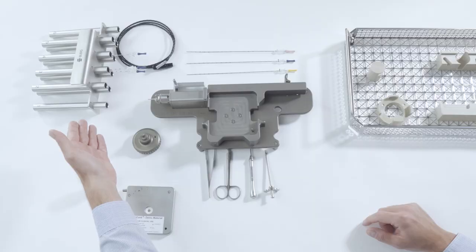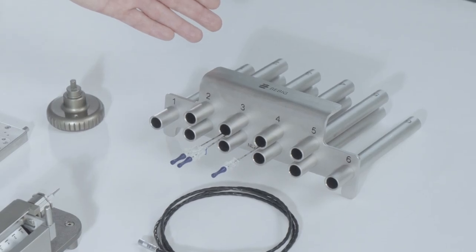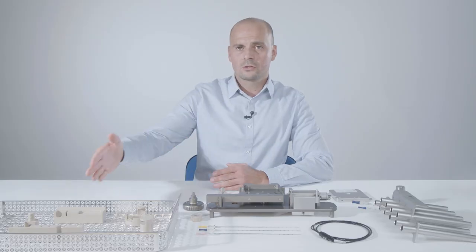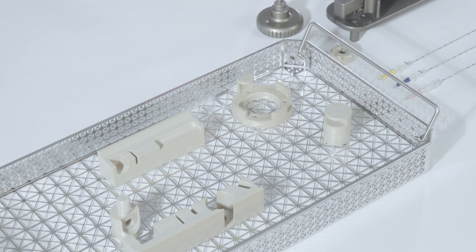The isocord needle magazine is used for temporary storage of loaded implantation needles. The sterilization tray holds the needle loading station and its accessories during the sterilization process.